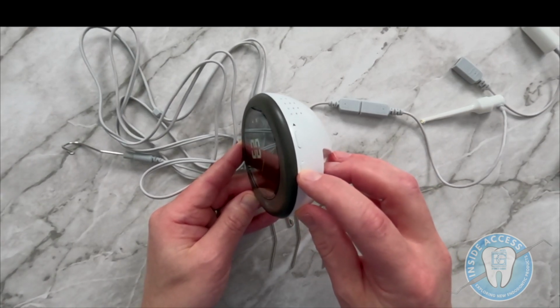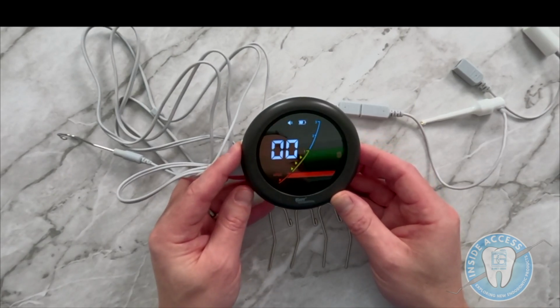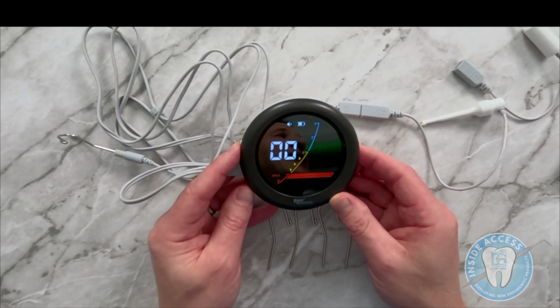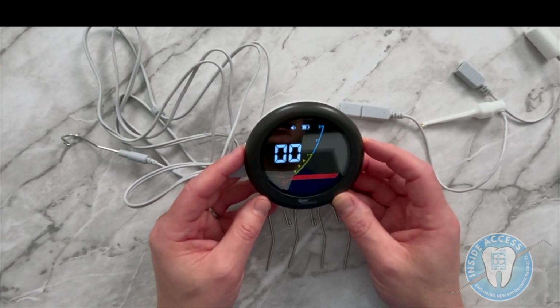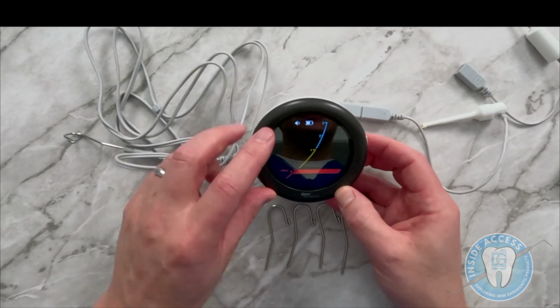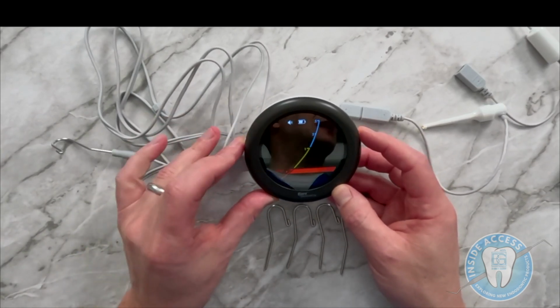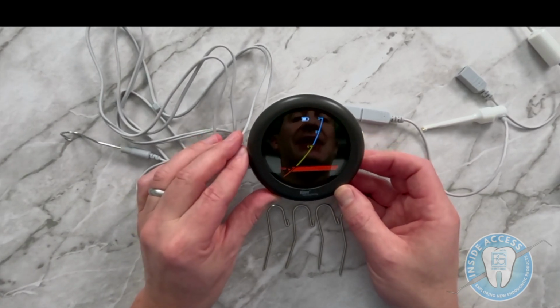So if I click this, you'll see what it'll first do is show me where the apex is at 0.0. Now, what's important to know is you can adjust this. I typically find this to be the ideal sweet spot for it. Now, if I click settings again, then we're going to get into the volume. You can see the volume is blinking here. So I can make it louder, I can make it turn off completely, or I can make it softer.